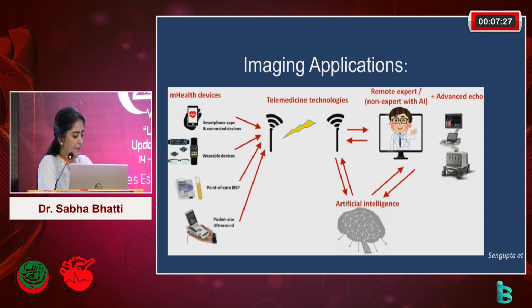But in addition to that, many of your patients are probably going to be wearing an Apple Watch or maybe have a smartphone that can measure their blood pressure, and there are phone applications out there now where we can do an echo. So I'm going to be talking about this point of care ultrasound where you can basically connect the probe to your iPhone or your Android phone and basically do an echo right from home.